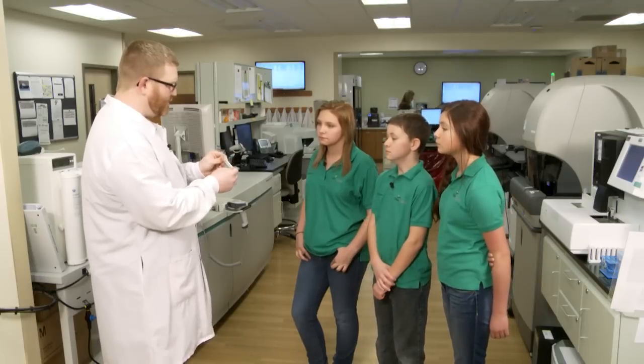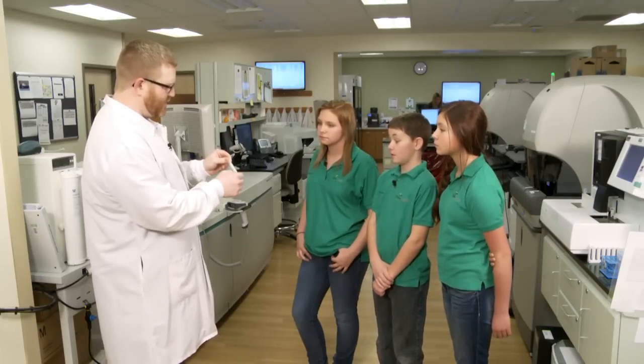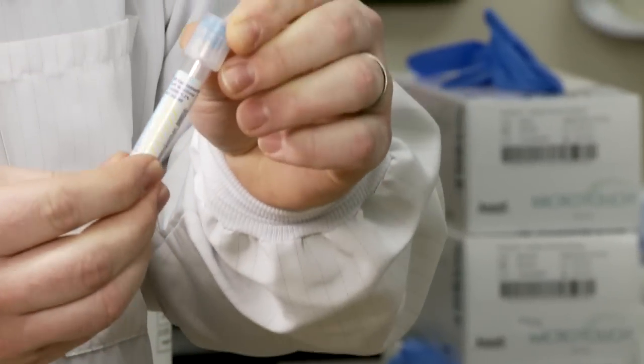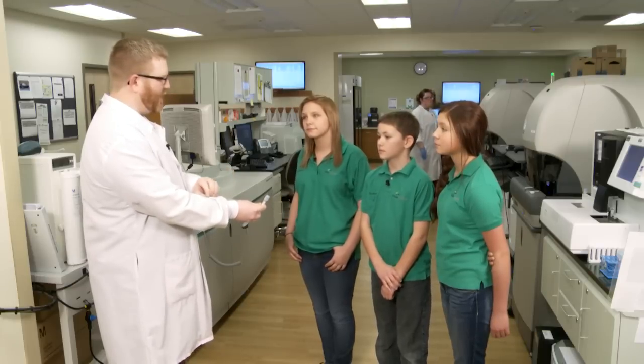We will also centrifuge — spin it really fast — to make the cells go all the way to the bottom, leaving just the liquid at the top. And this is for coagulation. That's to tell us if your blood is clotting right or not. So if you cut yourself on your arm, what happens to the blood?